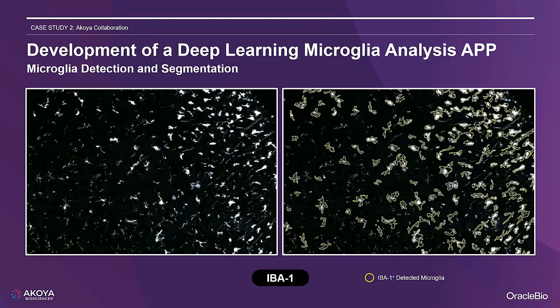In comparison, this is an example of IBA1 staining of the healthy tissue region of interest, where there is a much greater frequency of microglia with a ramified structure. Had we treated both populations of microglia the same, we would have failed to accurately capture and segment all microglia. Another benefit of Vis is that we can handle both populations individually, allowing for a more accurate segmentation profile.